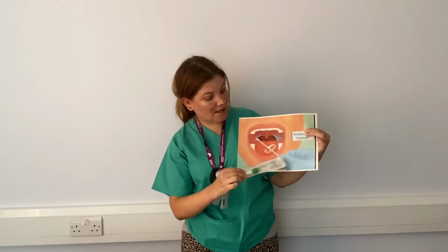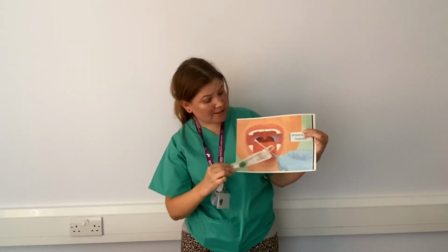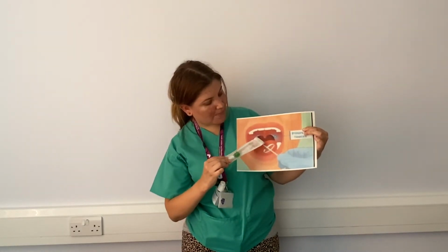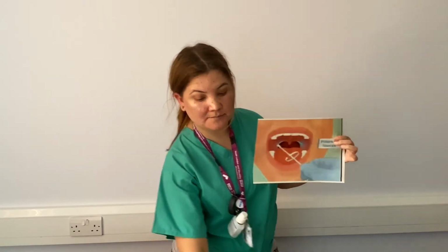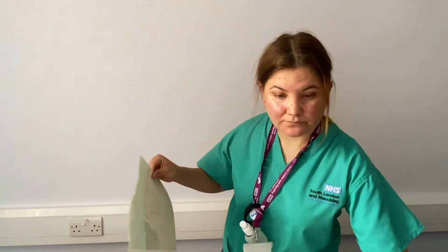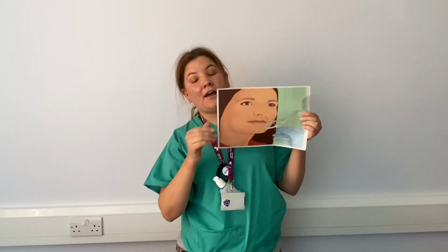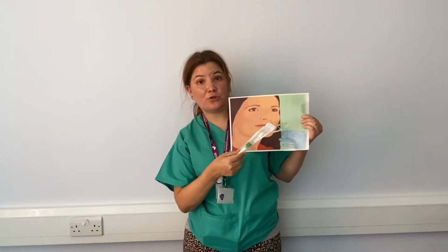Also, you can see that the hand doesn't touch the mouth and it's a circular motion. So please make sure you swab the back of the tonsils by the arch. Once you do that, you use the same swab and take a sample from one of the nostrils.